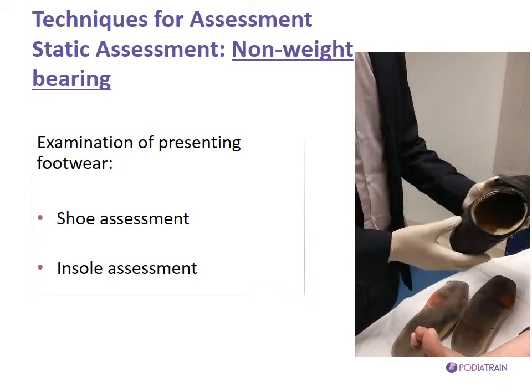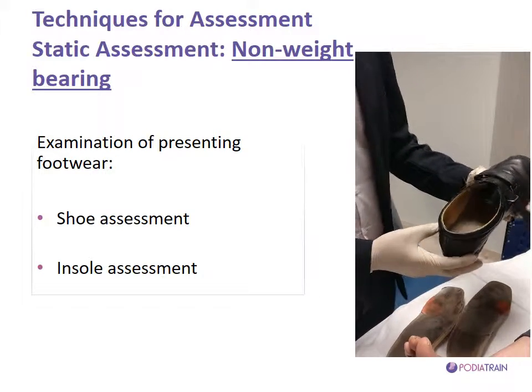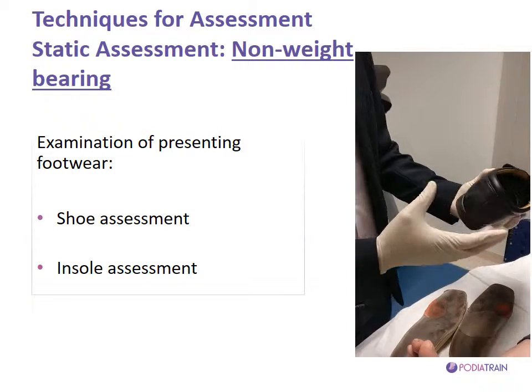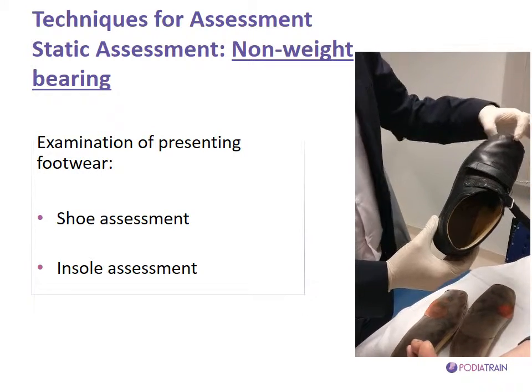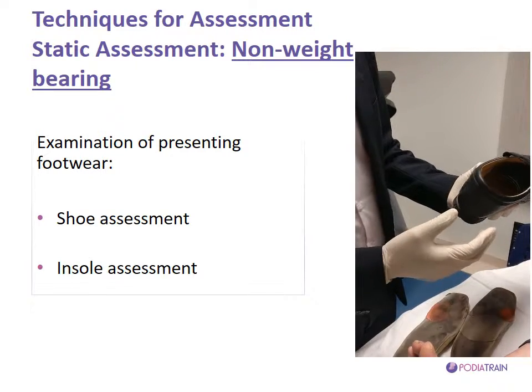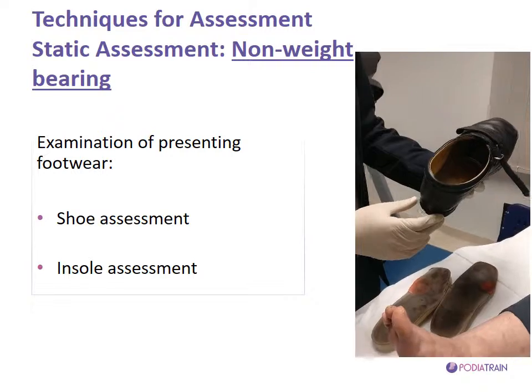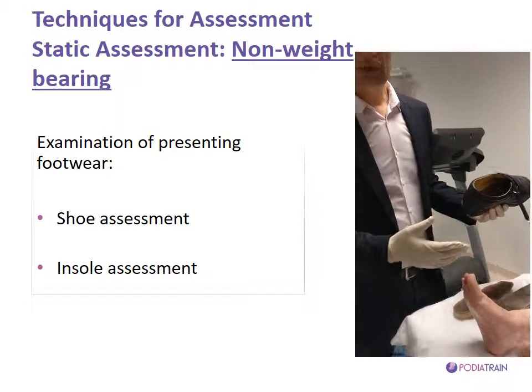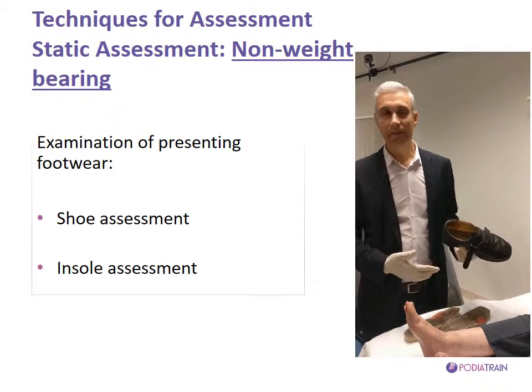Here we can see that she has been prescribed stock therapeutic footwear. So obviously they come with special features such as extra depth, most of the time they're seamless, quite wide in front, and extra cushioning at the heel area. So all these are parameters that we need to assess, examine, and possibly change.